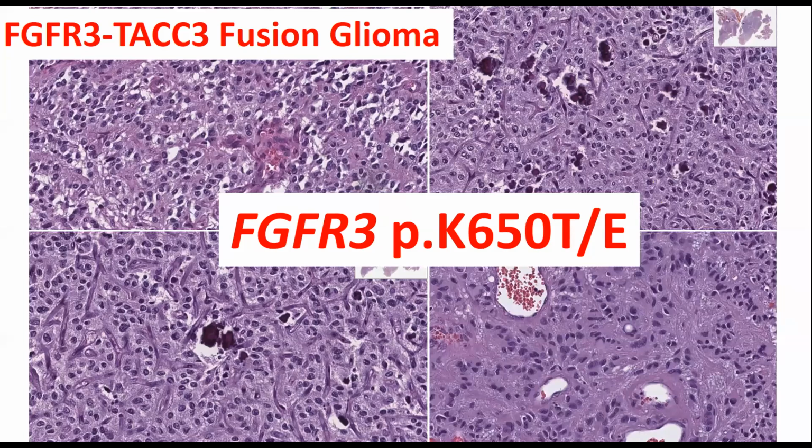All right, so here it is. If you were not familiar with this before, and I'm speaking to the diagnostic radiologist as well as the pathologist, burn it into your brain. Oligo-like features, but also with perivascular pseudorosettes like ependymoma, right?